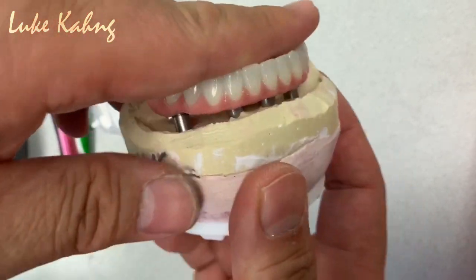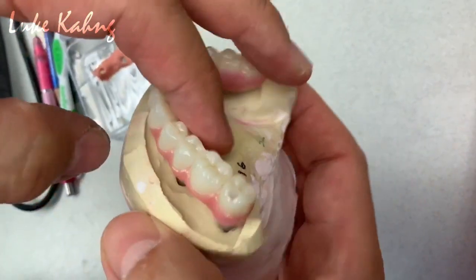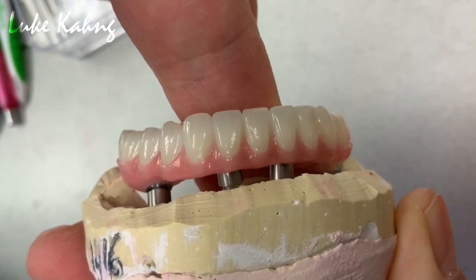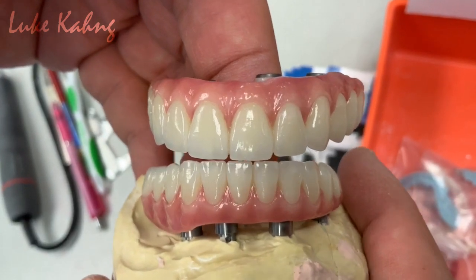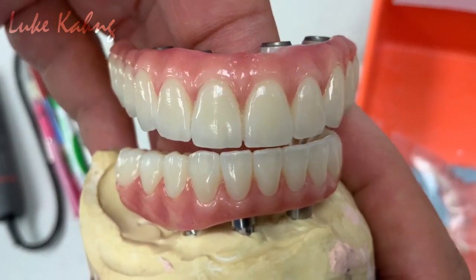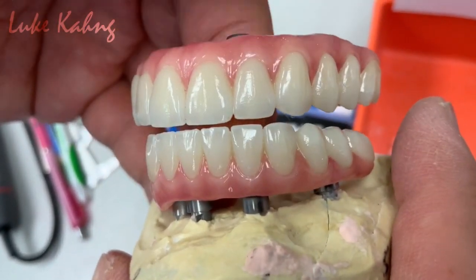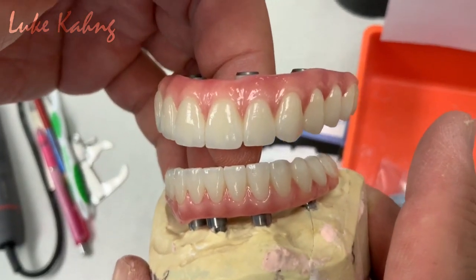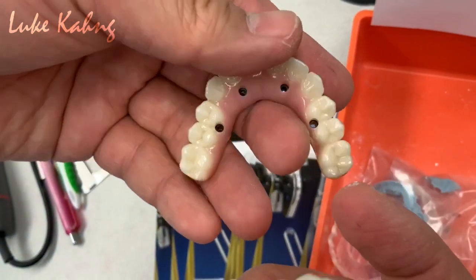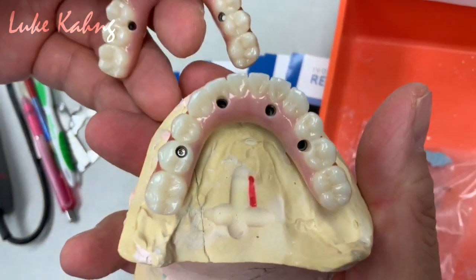Okay, look over. I did it all manually. There's some porcelain layering for the patient. Great. Alright, for this special patient, we created it as beautiful as possible, with the aesthetics, everything. We just finished it upper and lower. The excellent restorations, with the tissue, color, everything looks good. And occlusion, we're trying to make it the best we can, as much as possible.